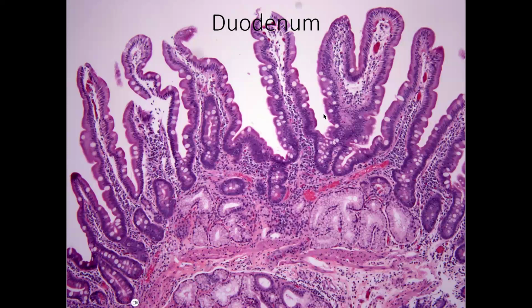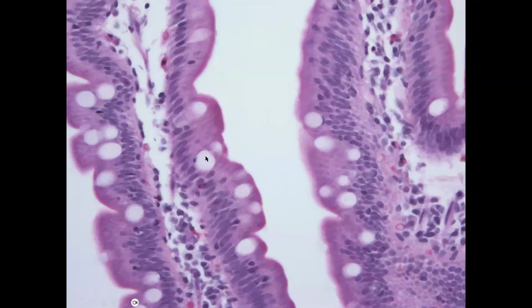So these are nice tall cells. There's not a lot of cellularity within the villi. We can see that here. So these are all epithelial cells. We're now in the intestine, so it's normal to have goblet cells, which you can see here. Then there's also these absorptive type cells that have this kind of eosinophilic reddish, refractile surface. So the little microvilli that help us absorb nutrients in the small intestine are present here.